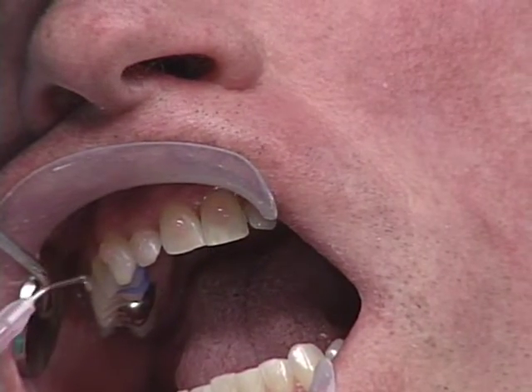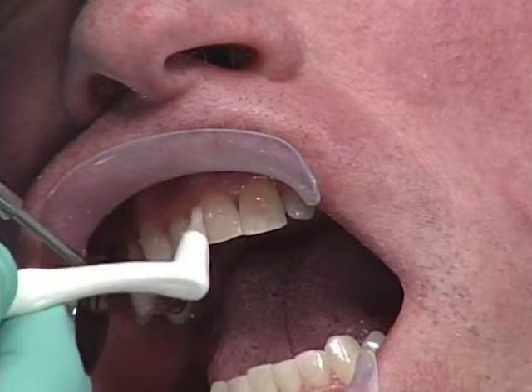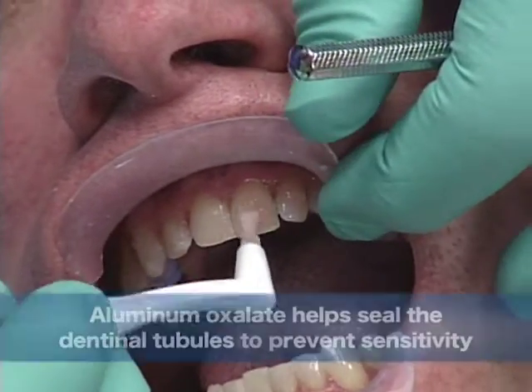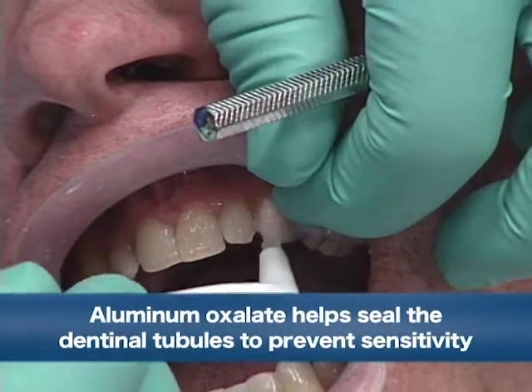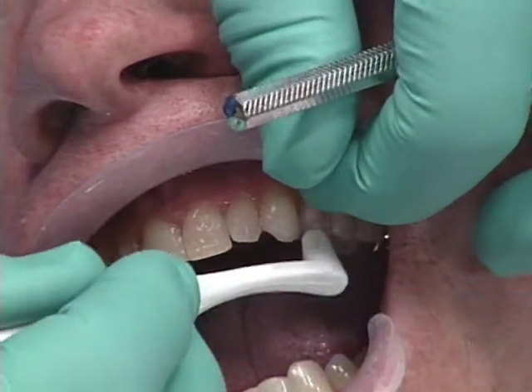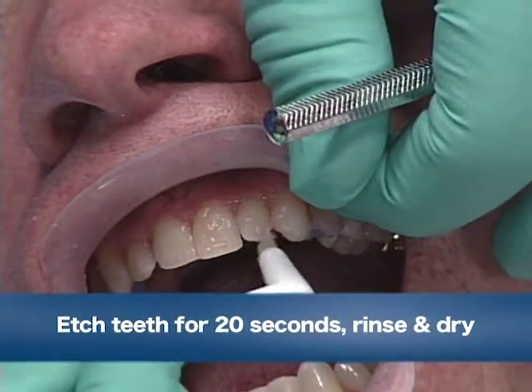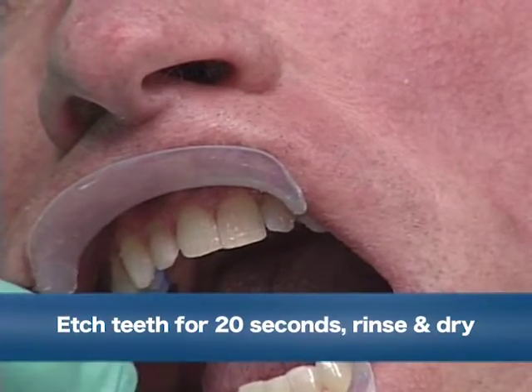We're going to begin the process by putting etch and seal on the natural teeth and then brushing that around. The reason I use etch and seal is it's 35% phosphoric acid with aluminum oxalate. So you can use it on your ordinary everyday operative procedures, and if you get it on the dentin, the aluminum oxalate helps seal the dentinal tubules to prevent sensitivity.